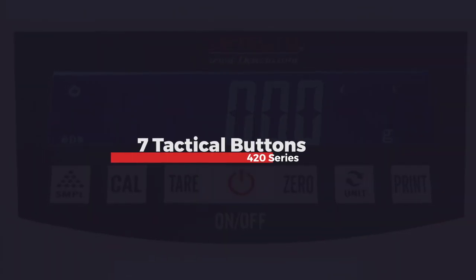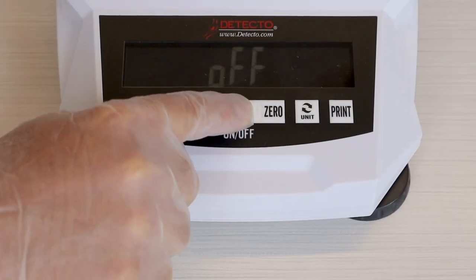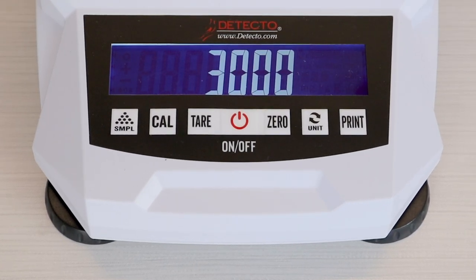The 420 series is very simple to operate and features 7 tactile buttons on the keypad. The commonly used red on/off button is located right in the very center for easy activation.